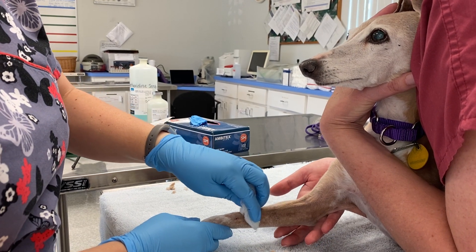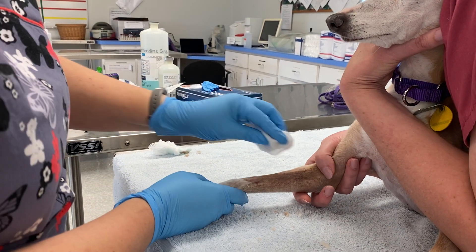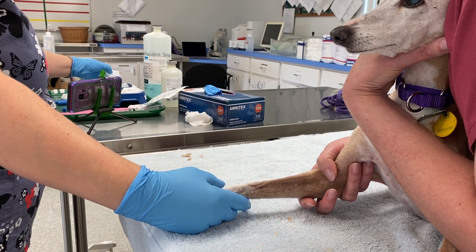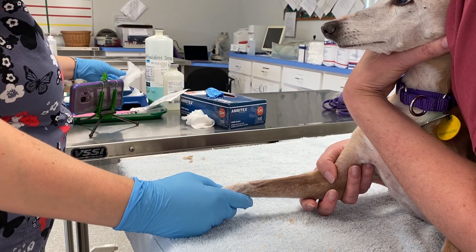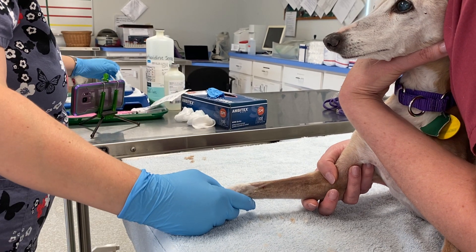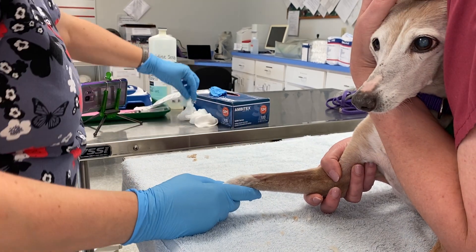Next step is to scrub your catheter site. I'm going to go ahead and just do one fell swoop straight down. You want to do this at least three times. The idea behind it is you want contact time — it's not whoosh, whoosh, whoosh and be done with scrubbing.